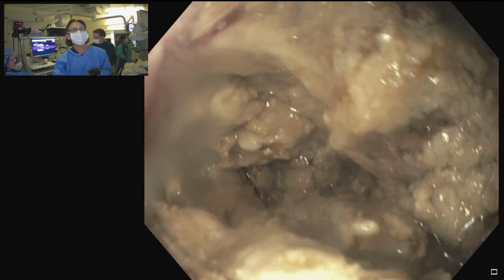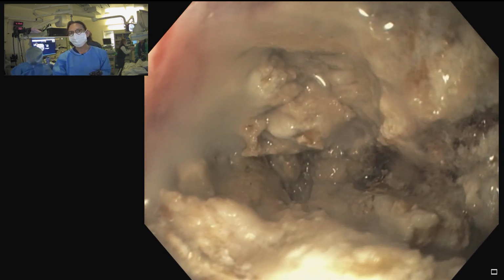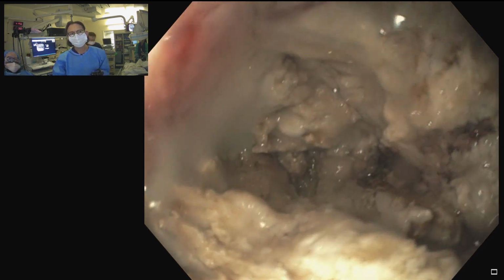Control room. All right. So now, hopefully you picked up, I was explaining before that I would place a nasocystic catheter for continuous irrigation at 75 or 100 cc's per hour.